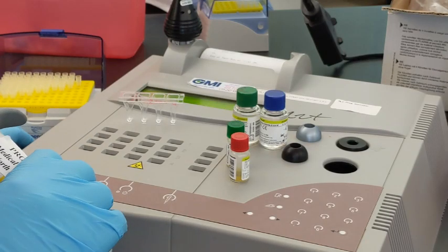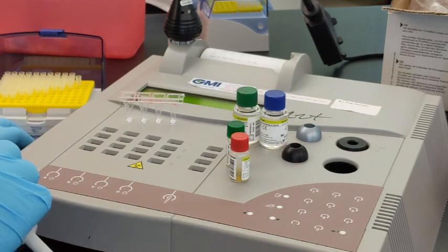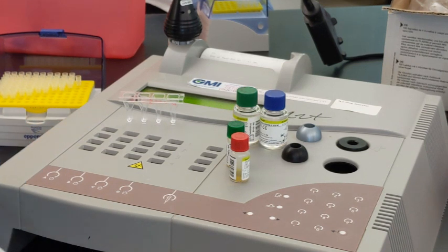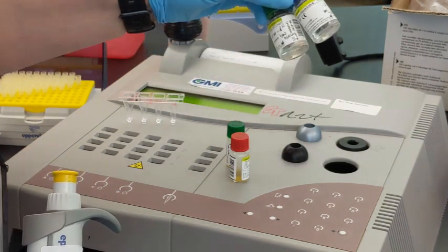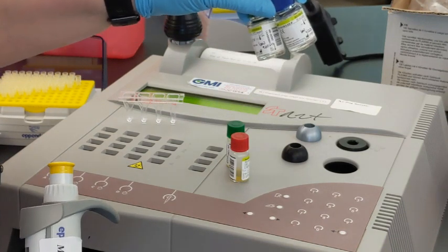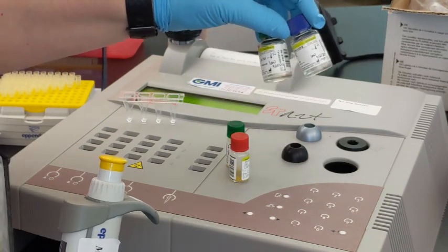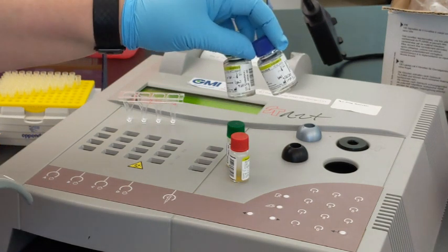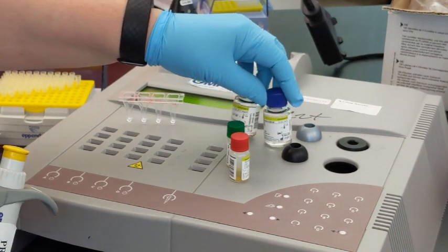So I'd like to take this opportunity to show you how to do an APTT test with the Stago Start. How we start, we're going to prepare our reagents according to manufacturer's inserts. What's kind of nice is that with many of the PTT reagents, they're already reconstituted for use. However, anytime that you open these reagents, you should date and time them so that you know how long they're valid for and when they would expire.